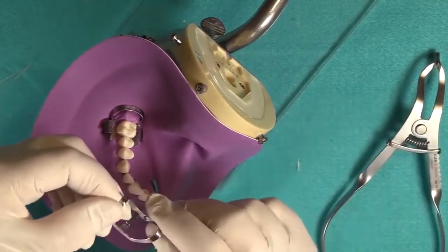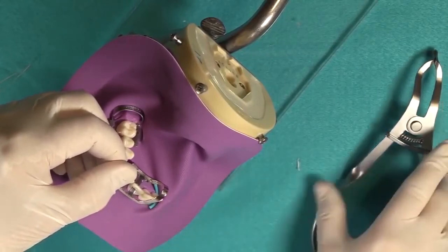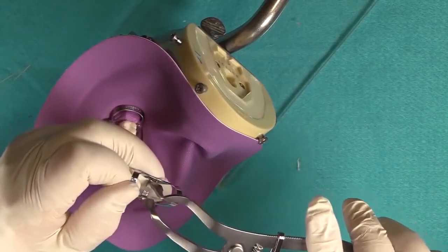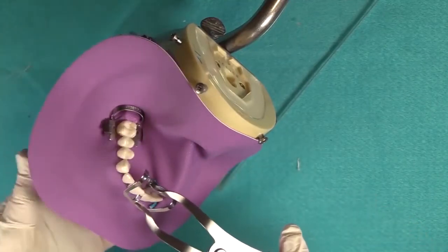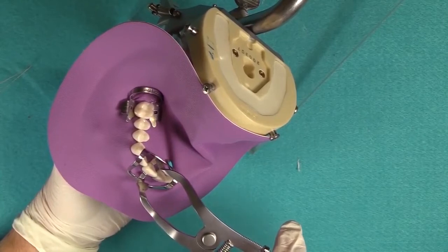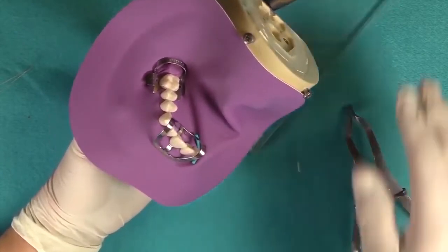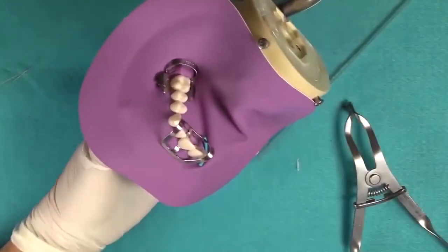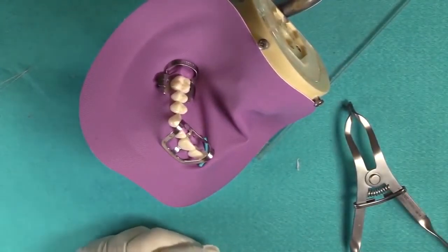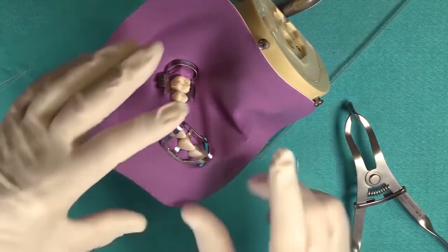So in my non-dominant hand, I hold the clamp the way it's going to go. Again, notice the slope. It's to the facial aspect of the tooth. So I engage the notches that are closest to my dominant hand. And then when I apply this, I want to gently slide the clamp very gently along the tooth surface, and seat it like that. It may not be easy to see on camera, but as she was sliding it down, slowly opening it with the forceps, following the contour of the tooth, and then once past the natural contour, releasing it a little bit so it stays tight against the tooth as you're pushing it down. Exactly.